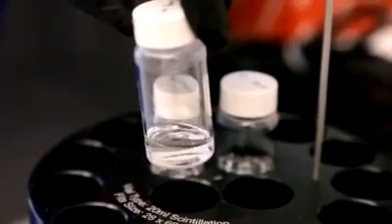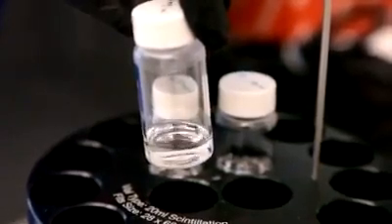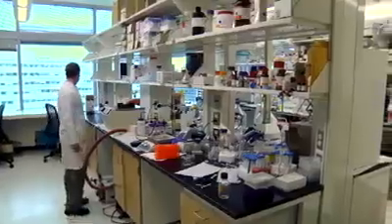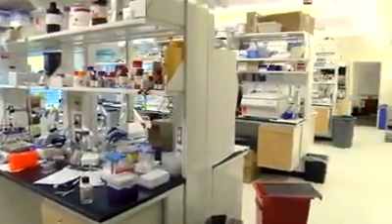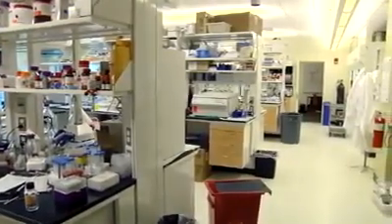That may soon change. In one test, their contact lens was able to deliver antibiotics to a sample for a period of over 100 days. So this contact lens could be used to treat perhaps glaucoma, intraocular or topical infections, such as a corneal ulcer. It could be also used to treat inflammation in the eye. In theory, it could also be used to treat something such as macular degeneration, which can cause blindness.